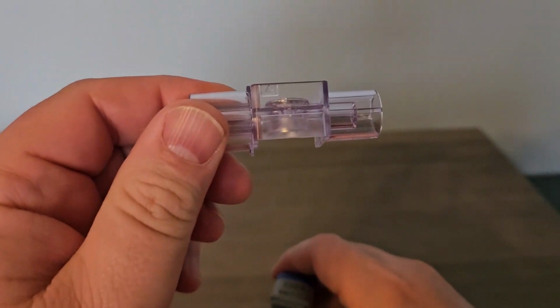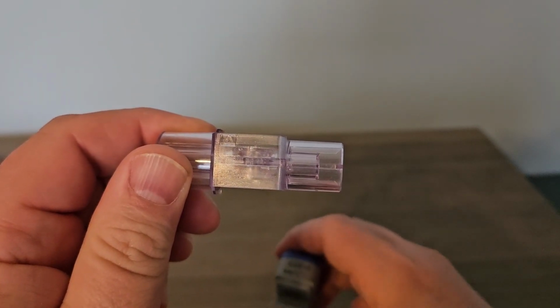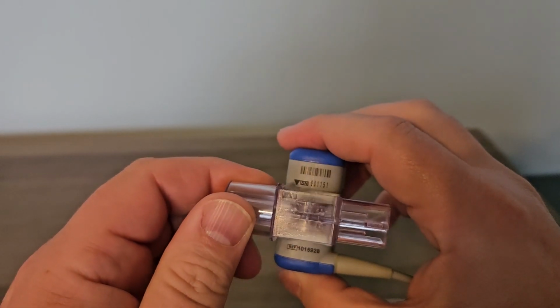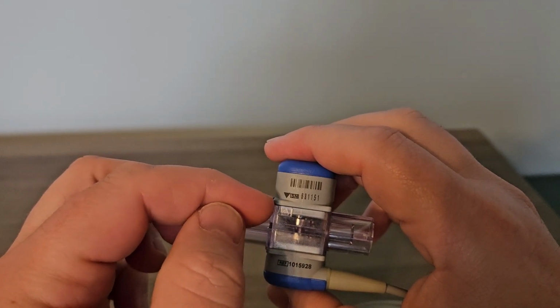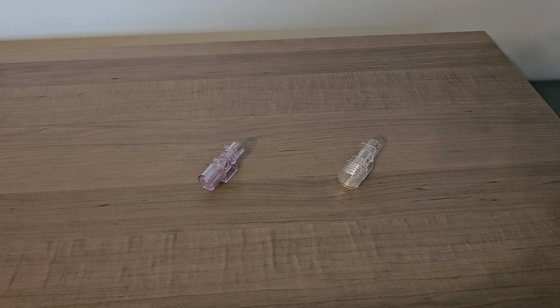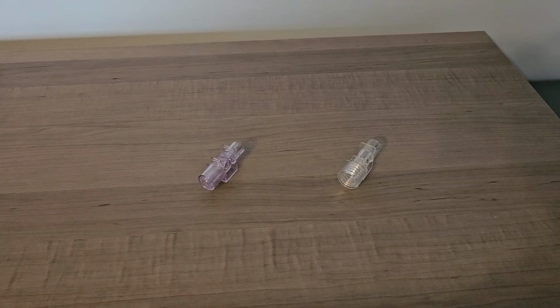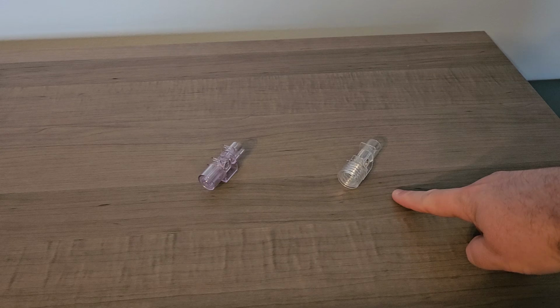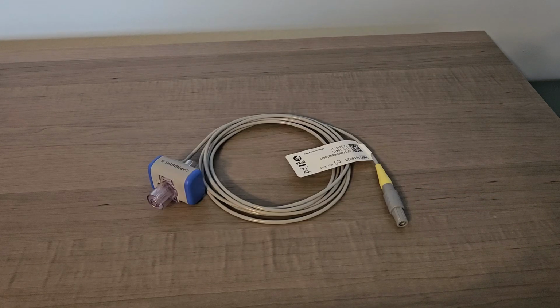When inserting the adapter into the sensor, look for the arrow on the adapter and the arrow on the sensor. Insert the airway adapter so that the two arrows are pointing at each other. There are two sizes of adapter included with the mainstream sensor. The purple-colored adapter is for endotracheal tubes that are less than or equal to 4 millimeters, and the clear-colored adapter is for endotracheal tubes greater than 4 millimeters.